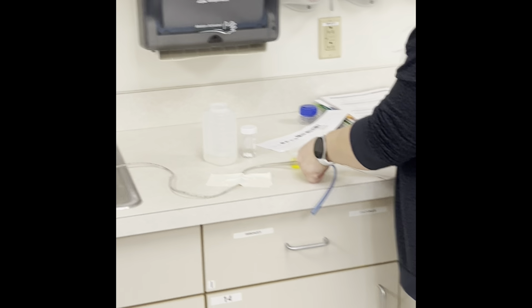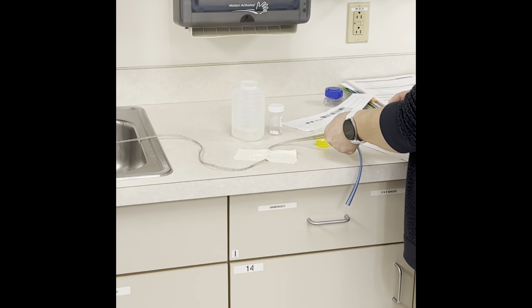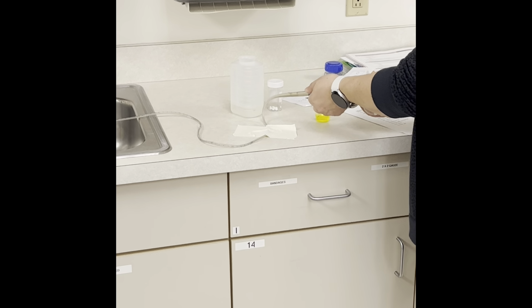Drop some water. We're gonna just clear the tube. Can you see how it's bubbling in the container? So we cleared our tube. I would put my cap back on.